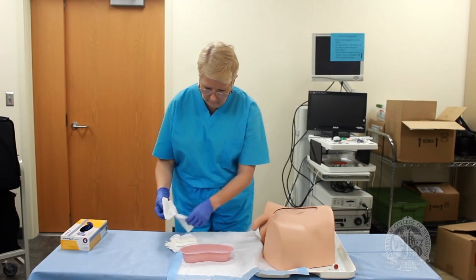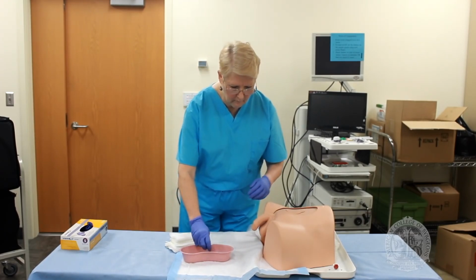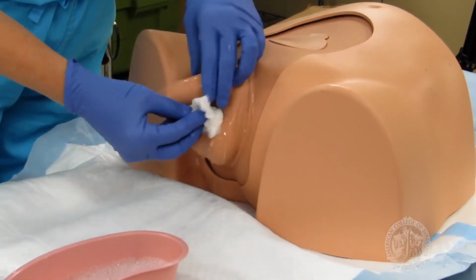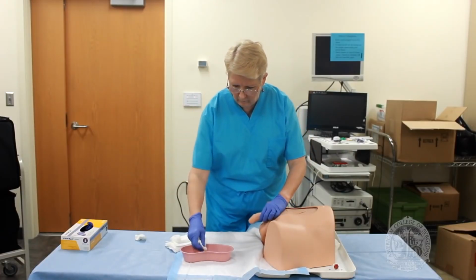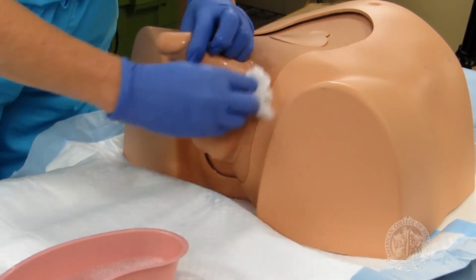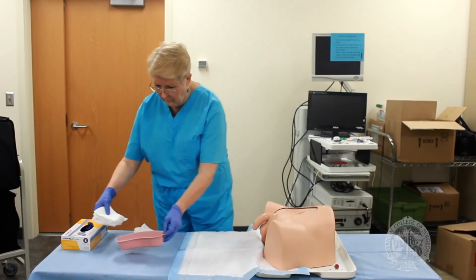Sanitize your hands and put on non-sterile gloves. This first part is not sterile. Cleanse the penis with towelettes or with soap and water, making sure to retract the foreskin if present. Note to self, if you do this at the end of the procedure, you must return the foreskin to normal position in order to avoid iatrogenic paraphimosis, which is a urologic emergency.